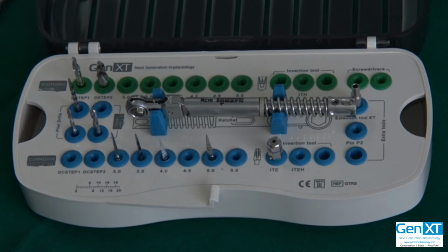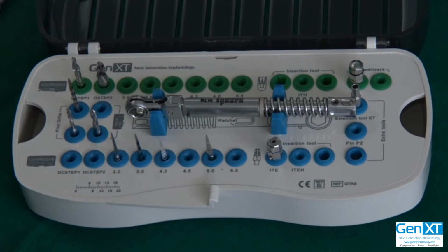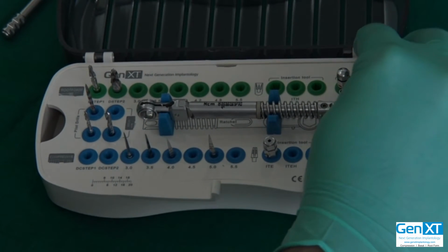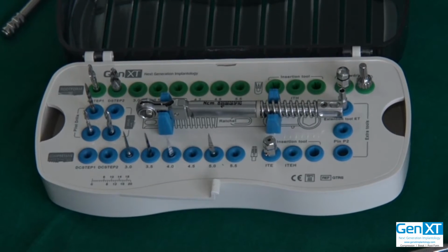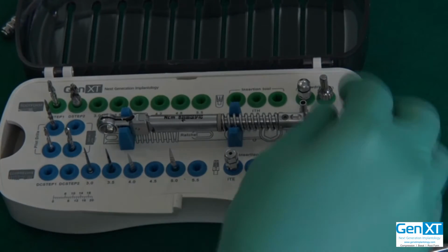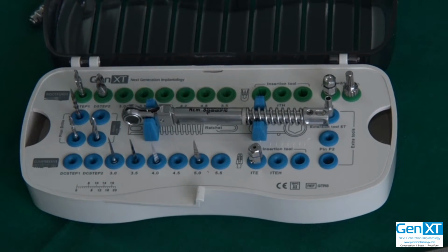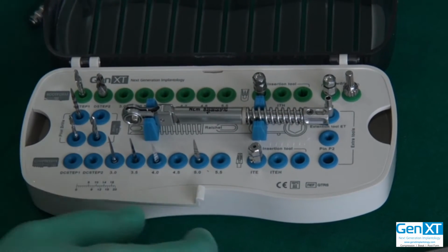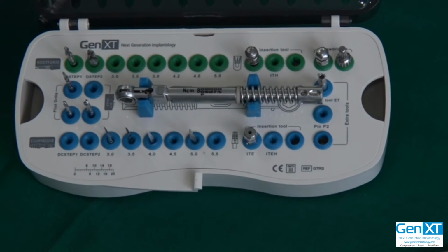In addition to that, you will have the SDL, that is the screwdriver. And you will have what we know as the SR, that is the screw remover for removing the abutment. I will explain all the tools again. I am just placing them in there, and then you have the placement aid for the 2-piece implant. So this is what a kit would look like if it is both single piece and 2-piece.